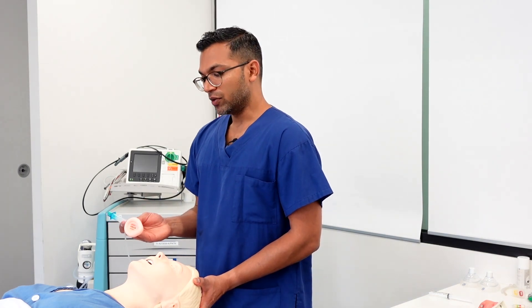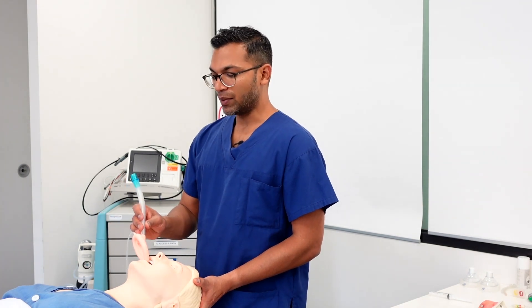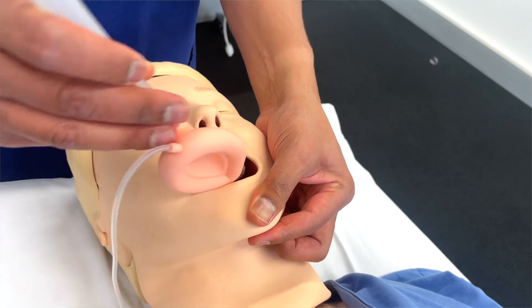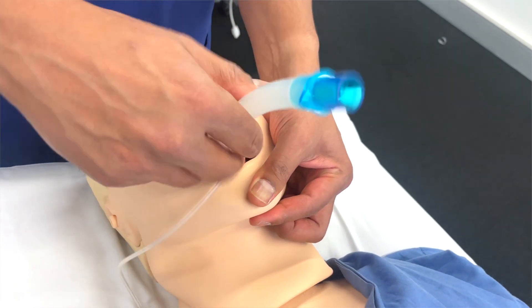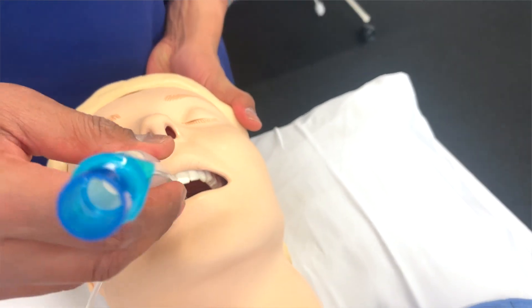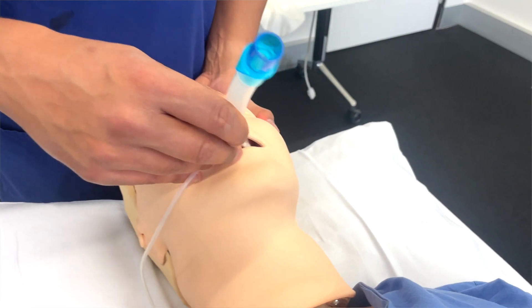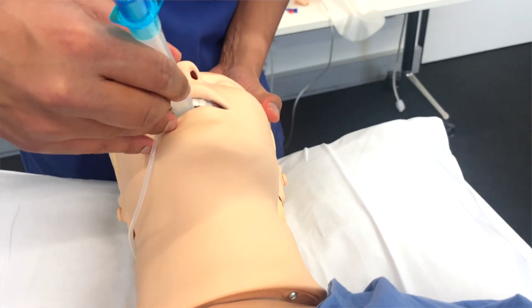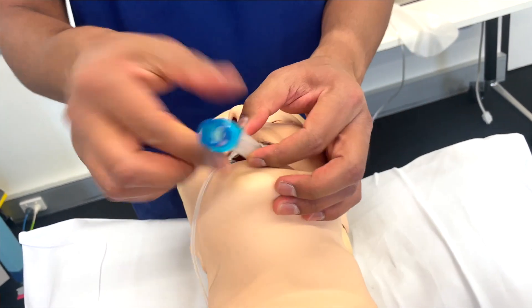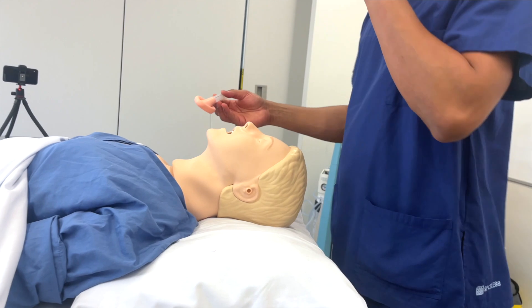If you have a patient with very limited mouth opening, you'll need a low-profile device, potentially like a fast-track LMA, to get through. Two centimeters is probably the bare minimum you need. With the mouth open, I push it back — the first resistance you'll get is the tongue. Sometimes there's resistance that doesn't allow you to place it, so I apply a light bit of pressure and it then sits correctly. You'll feel a bit of a pop and a rise in the larynx as it goes down.